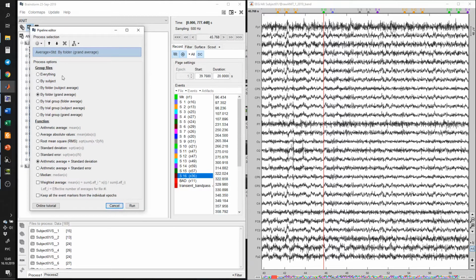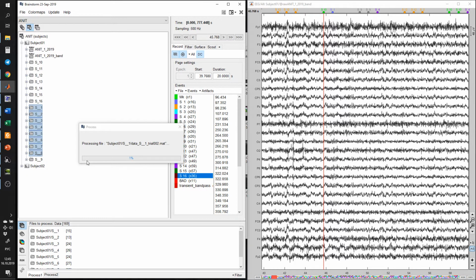I want you to average everything, since we have only one subject, and I want you to mix together all of the deviant stimuli, so everything here. And now I want you to choose here the arithmetic average and standard deviation option. Okay, then you press run.